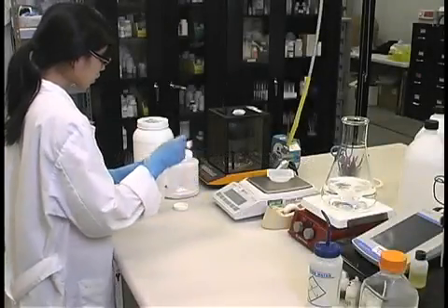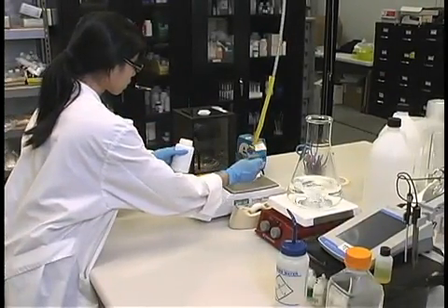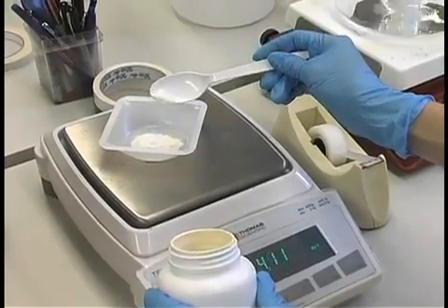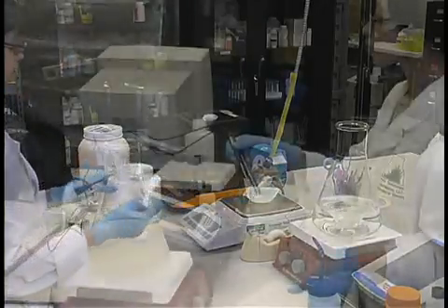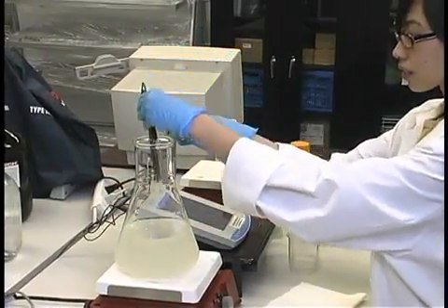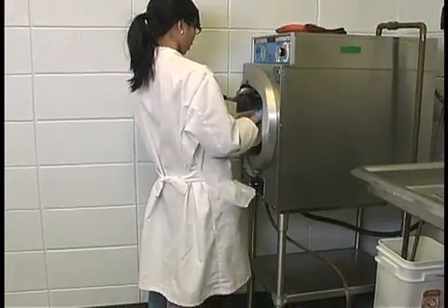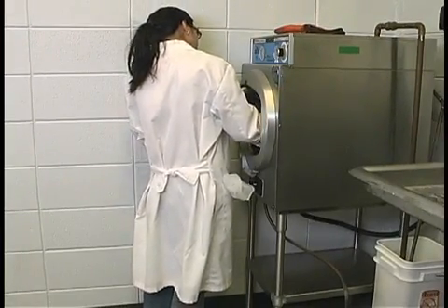The purpose of this video is to demonstrate techniques for media preparation when using a gelling agent. While there are many different ways to prepare media, this video will discuss recommendations on preparing media from a dry powder formulation, methods for adjusting the pH of the media, and different techniques for sterilizing the media. This video will also assume that you have an autoclave or pressure cooker for sterilizing the media.